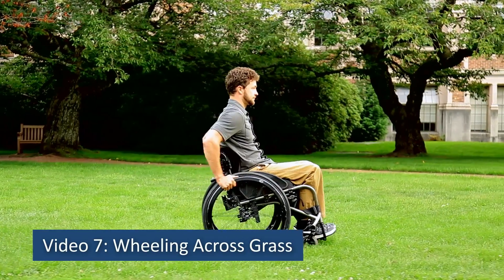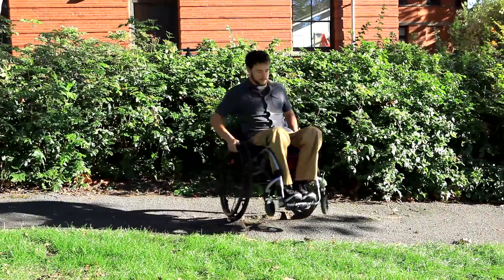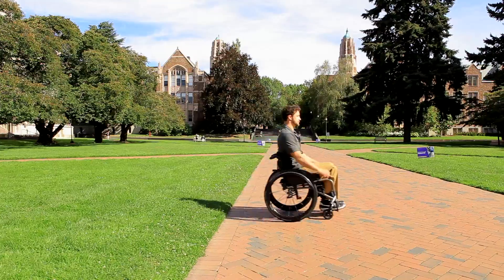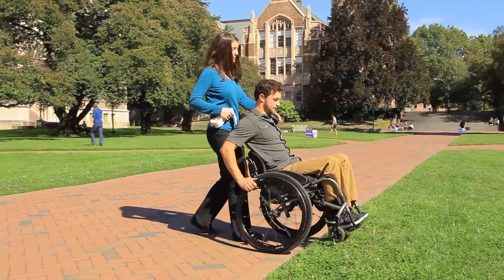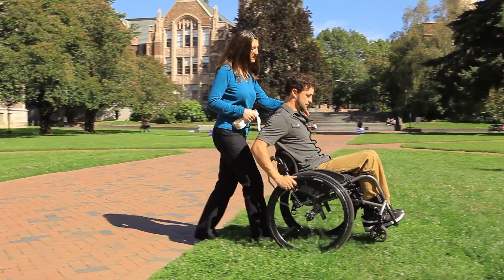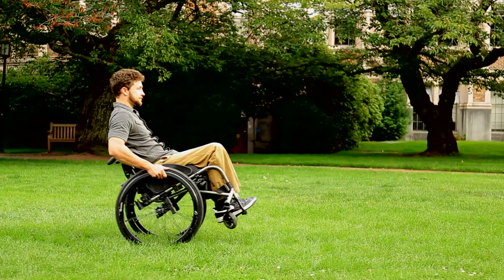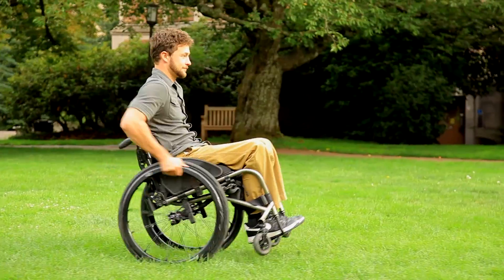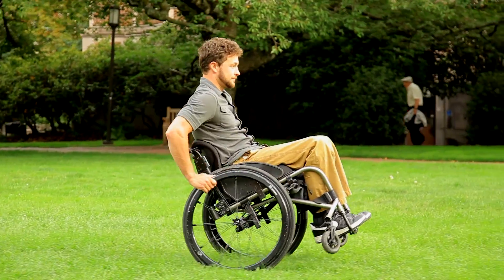Wheeling across grass: you can use a wheelie to push your wheelchair over uneven or soft surfaces such as grass or gravel. Practice by approaching this terrain with a spotter and crossing in a full wheelie or in a series of pop-ups. This keeps the front wheels free from sinking or dragging into the lawn.